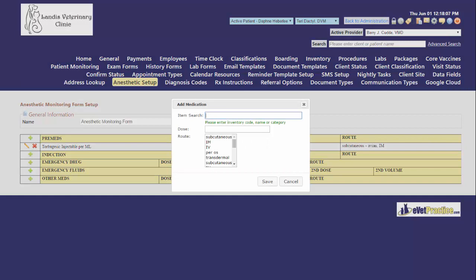In the item search box you can search by inventory code, by a portion of the name, or the category for the drug that you want to add to the anesthetic monitoring form.